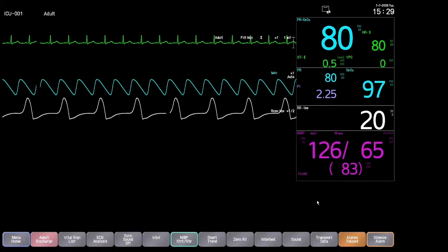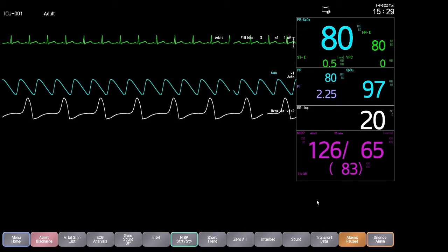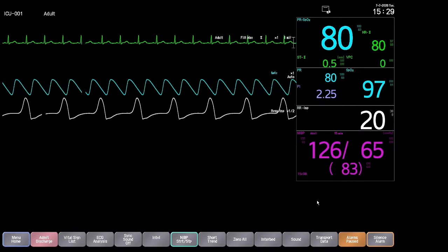This video will demonstrate basic functions of the non-invasive blood pressure, or NIBP, module, including choosing the NIBP cable, NIBP settings, interval, manual, stat, and venous puncture, and reviewing alarm settings.